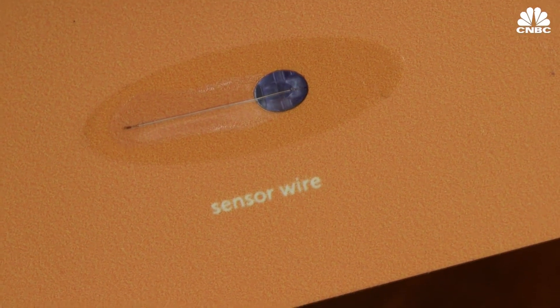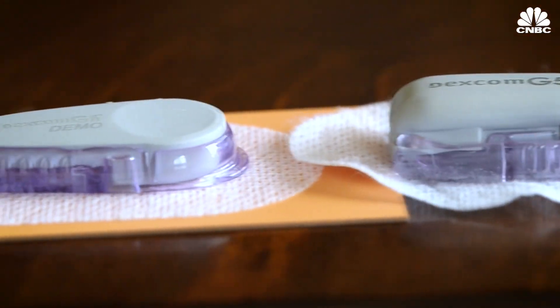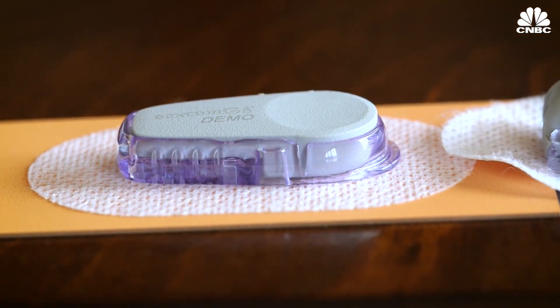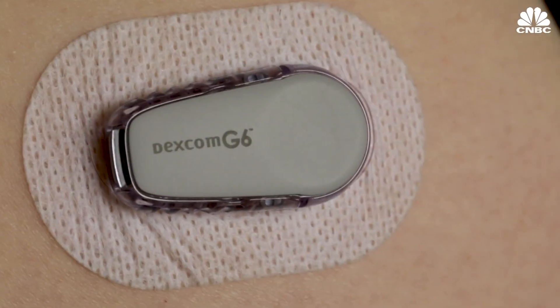The best thing about this sensor is that it feels smaller than the last one. To someone without diabetes or who hasn't worn a CGM, the size difference probably doesn't look that big. But for me, I can already feel how much slimmer it is, especially when I'm in bed and sleeping on my stomach — I don't feel the sensor, which is a huge improvement from the old one.